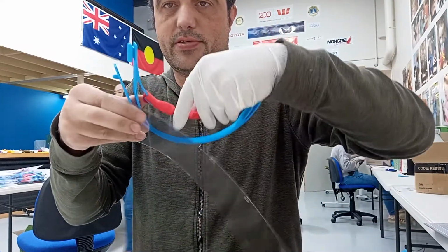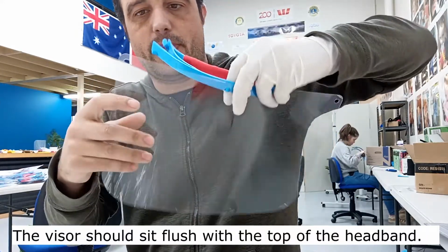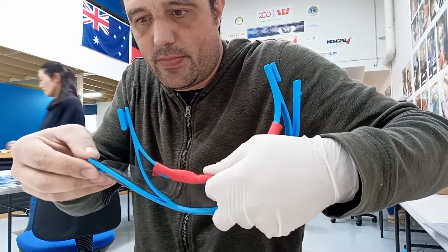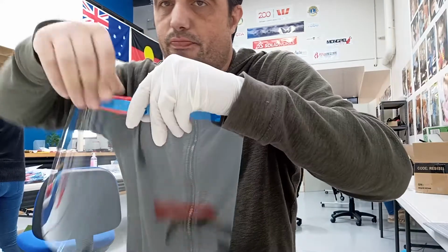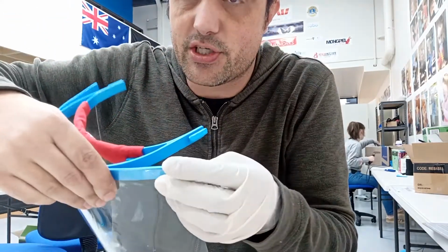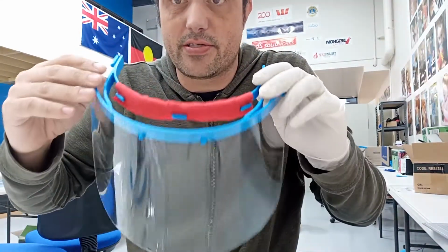There are 4 mounting points. The 2 central ones have a little bit of play in there to allow you to assemble it. And the first one goes on quite easily. Yeah, that's a good angle. So you can actually bend these arms out a little bit. So that's just snapped on there. And now the last one comes around. And you can see it is a little bit shorter by design. So this actually bends out and then should snap into place. So now it's nice and tight.